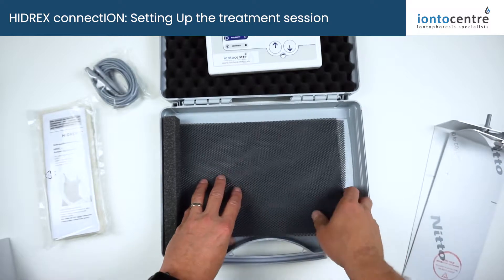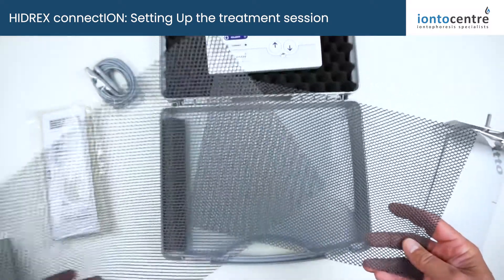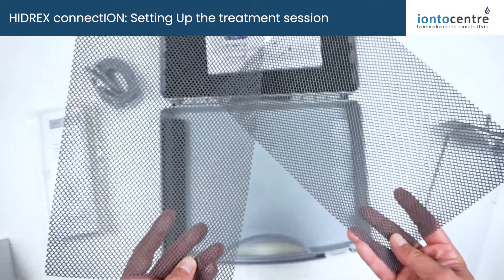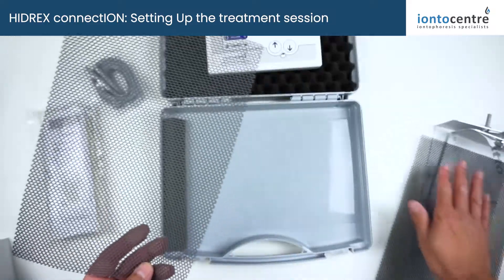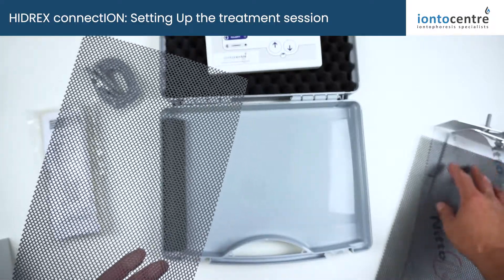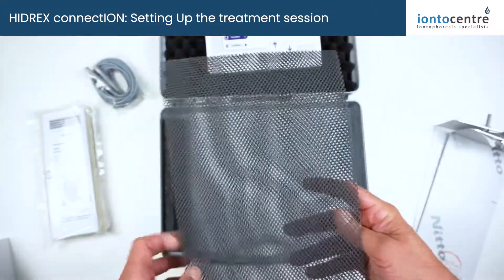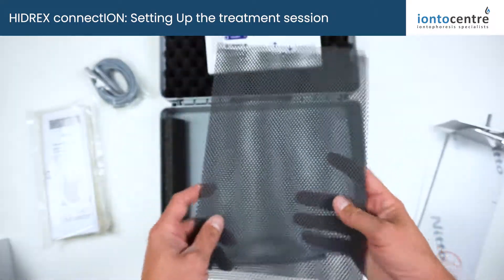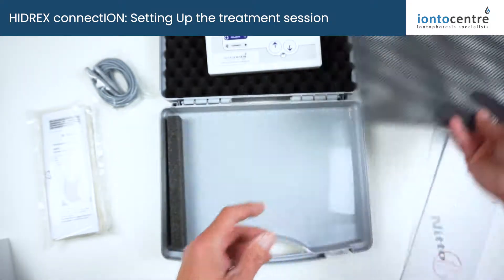Also new for this year is the removal of the towels that you used to get for treatments. Now you have these plastic distance grids which go over the electrodes and form a barrier between your skin and the metal parts of the electrodes. They're much easier to clean, much faster to dry, and basically last forever — so they're a lot better than the treatment towels.